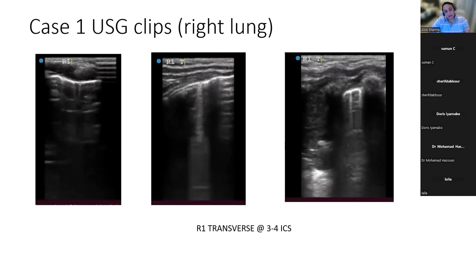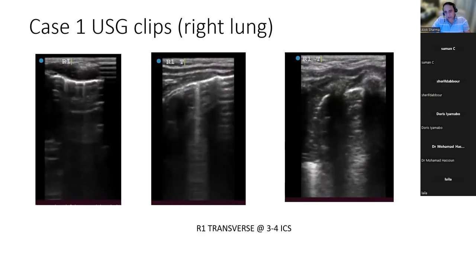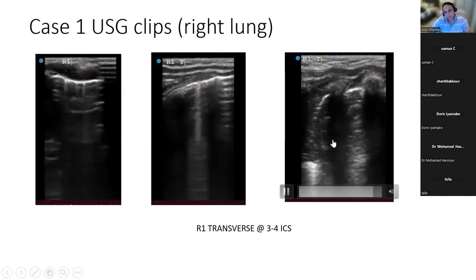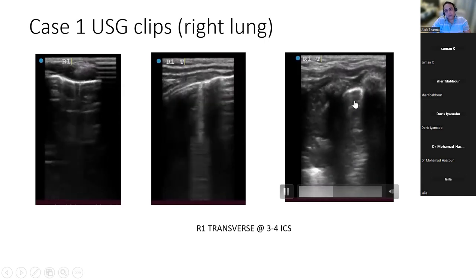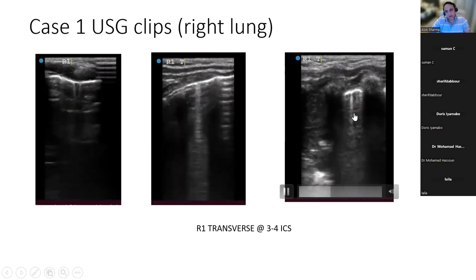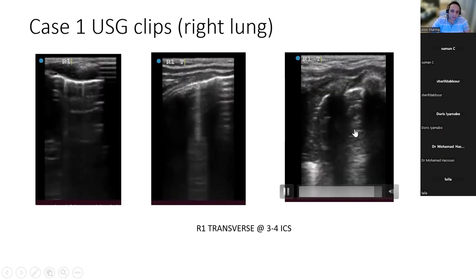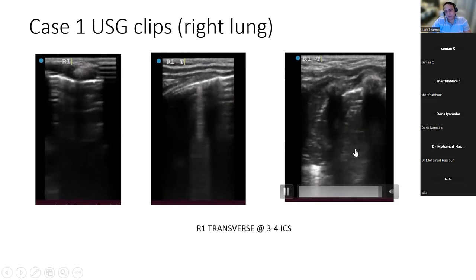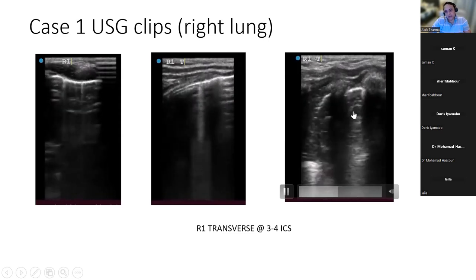So if you take your cursor, go to the middle, top pleura. Okay? So that entire zone is consolidation. Right. B profile. Okay? It becomes deeper consolidation as you move in. Now, as you move up, move up to the pleural line and move left.